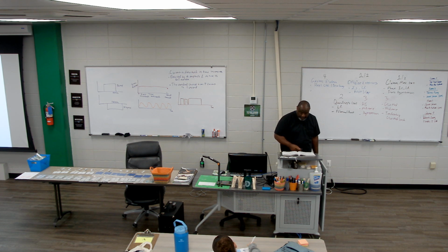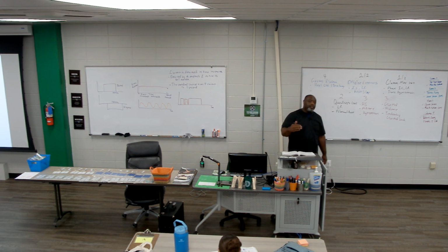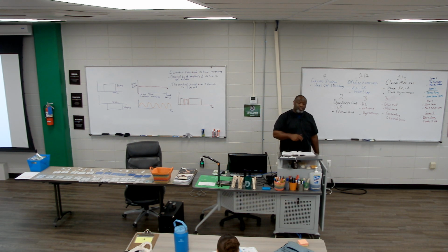It says, unlike DC, because it interrupts, it will not have negative effects underneath the electrode relating to skin issues. So I'm not worried about pulse current burning the skin because it has interrupting properties. Because it interrupts, we're not worried about it carrying a charge long enough to damage the skin.